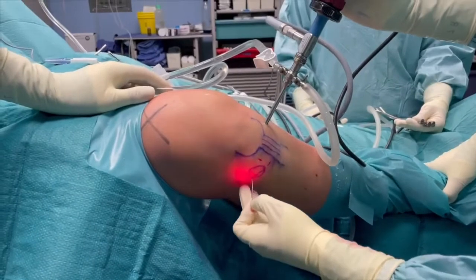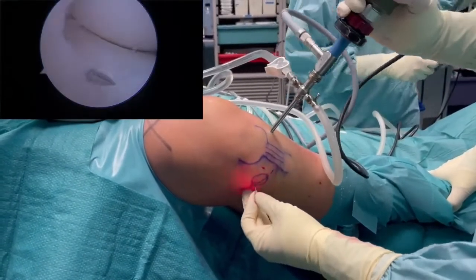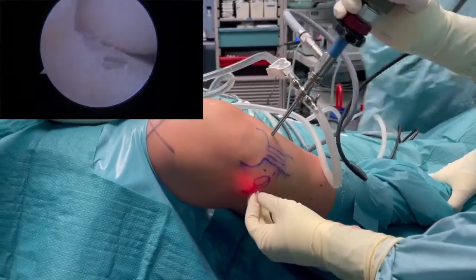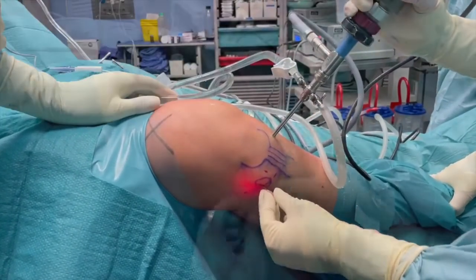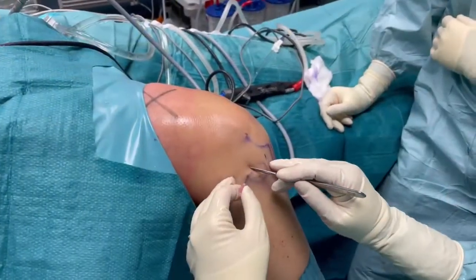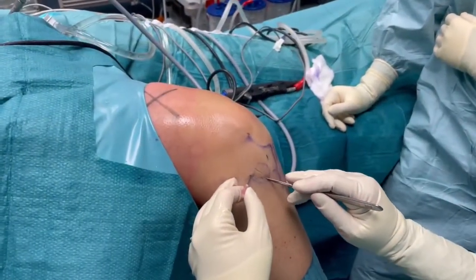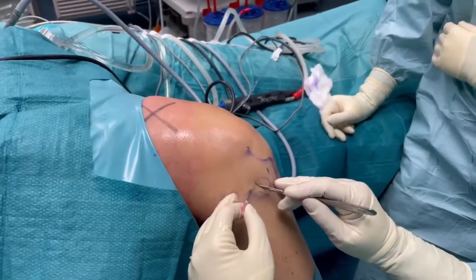An 18-gauge needle is used under arthroscopic vision to locate the exact points of the meniscal tear. An oblique skin incision is made in correspondence with the cyst.